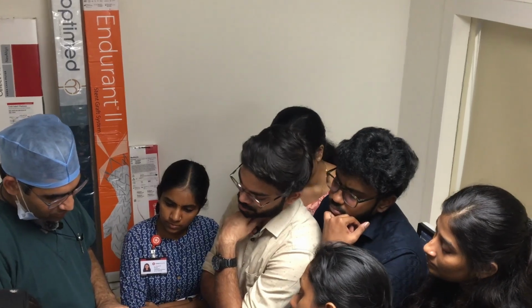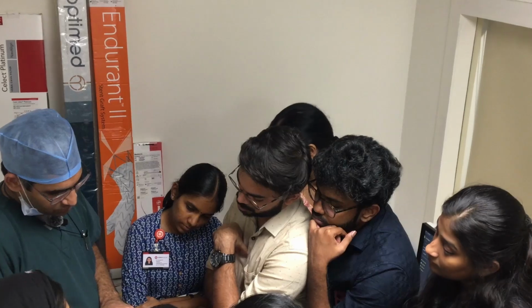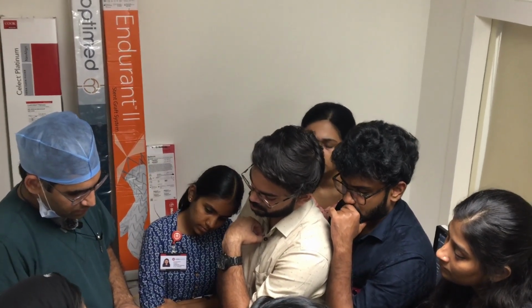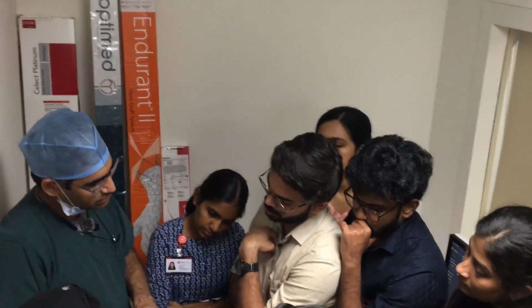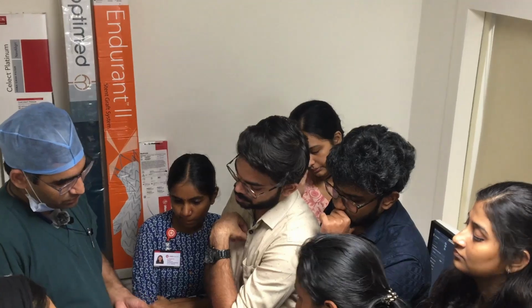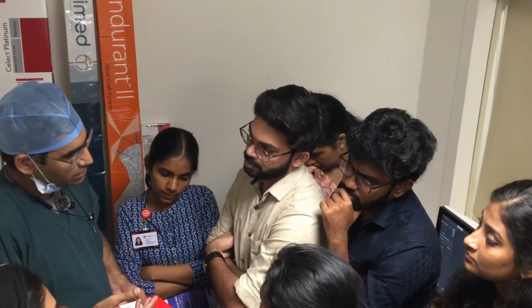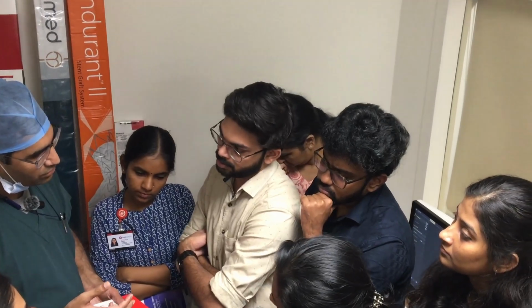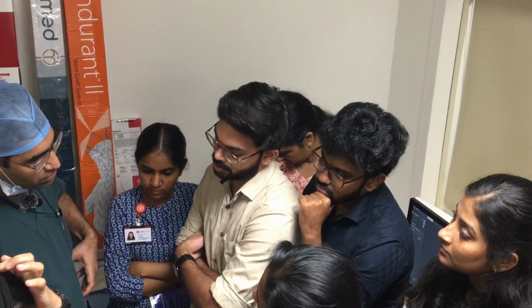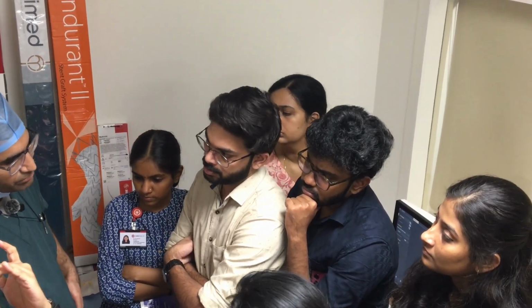Then balloons have a nominal pressure. So this balloon is at 10 atmosphere. It is nominal, so more or less at this pressure it will achieve this diameter. That is one way of classifying balloons, and another way is based on their compliance: compliant, non-compliant, hyper-compliant. Non-compliant or semi-compliant balloons are what is used for angioplasty.